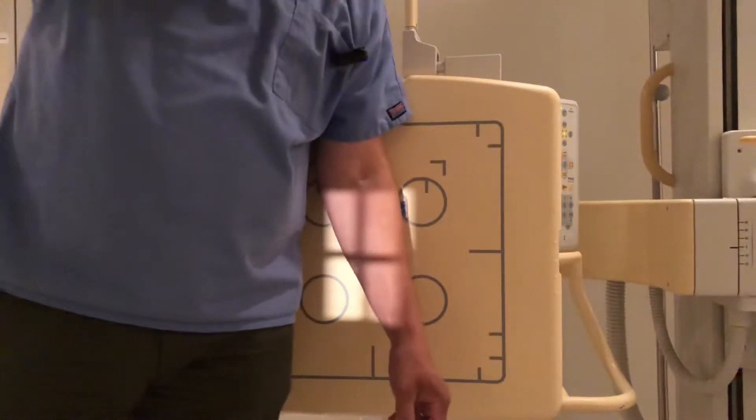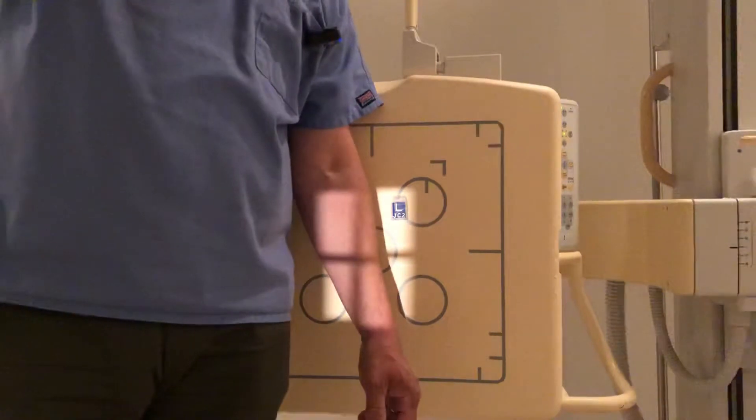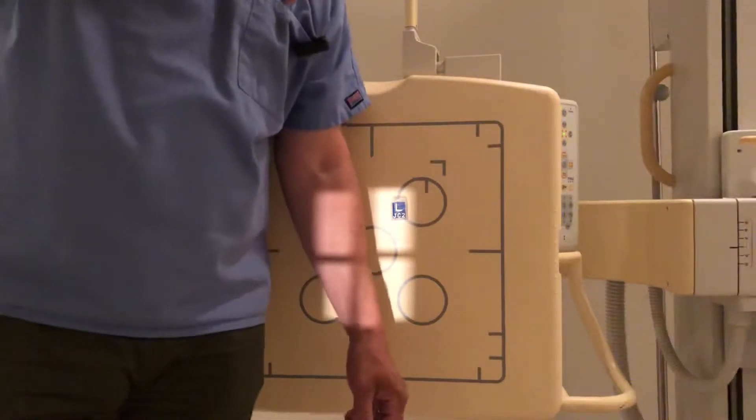Alright, you clicked on this link because you want to know how to take an x-ray of the trauma elbow series when the patient is flexed and cannot straighten their arm up. I'm going to show you how to do it perfectly every time.